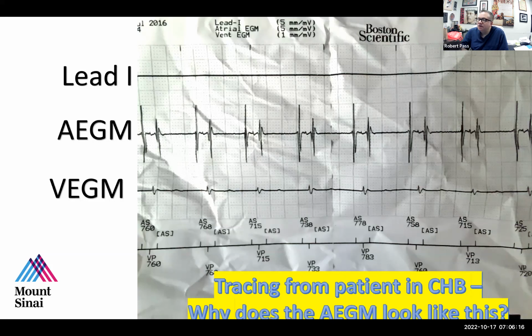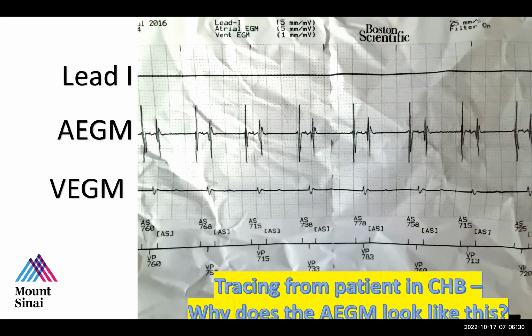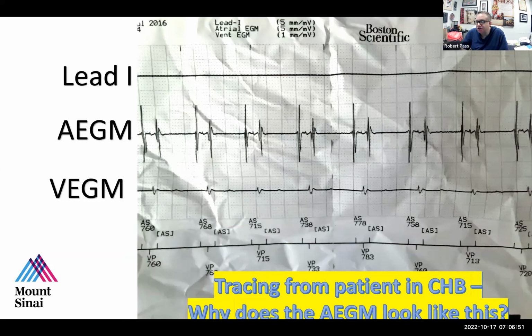So, any reason that you could think of why in the right atrial appendage, Maya, we might be recording the ventricle? Well, trying to think anatomically, I guess if it is overlying the ventricle or in close proximity to it, we might pick up some of the signal. That's exactly right, actually. The right atrial appendage hangs over part of the right ventricle. If it's large enough, it can actually be over the outflow tract of the right ventricle.